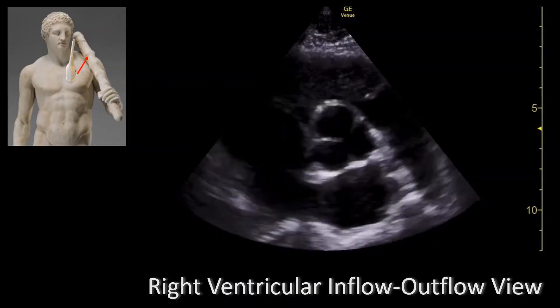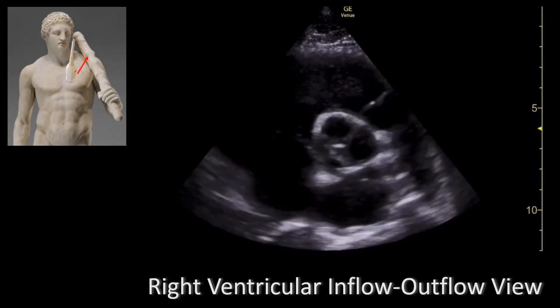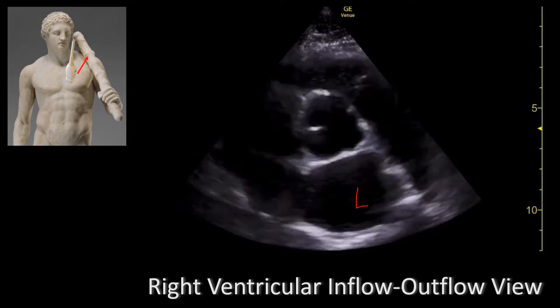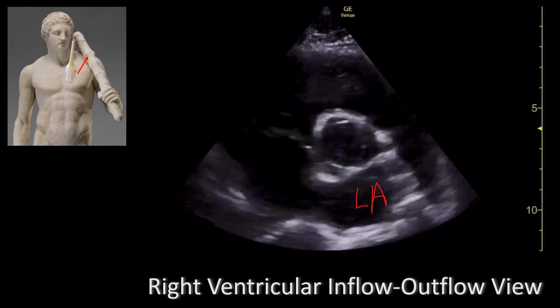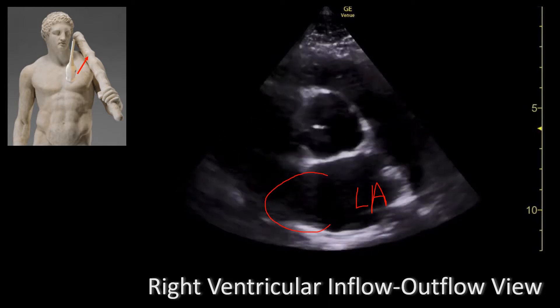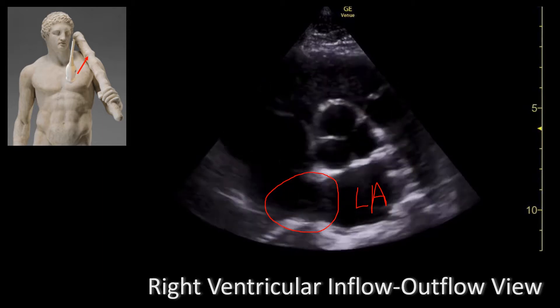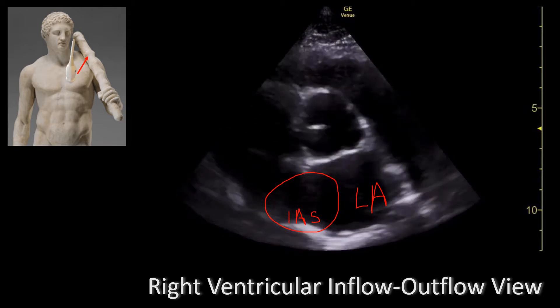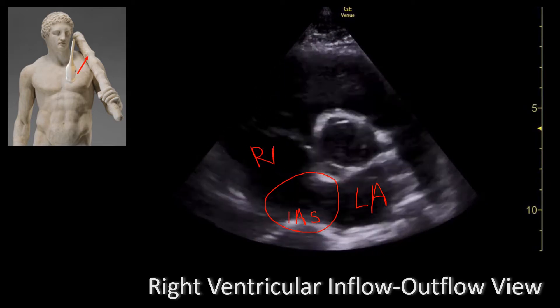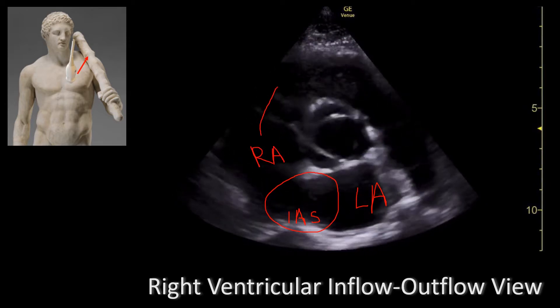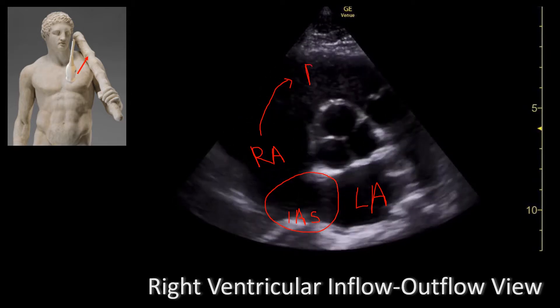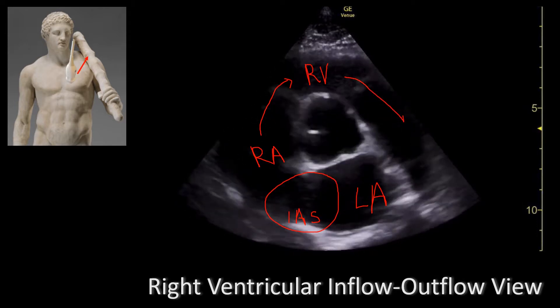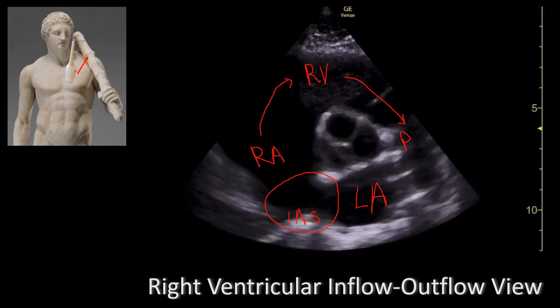Now let's talk about the structures we're looking at in the right ventricular inflow outflow view. The cavity that's farther away from your probe is going to be the left atrium. What I'm circling right now is actually not very clearly visible in this particular case, but it's the interatrial septum. On the other side of the septum you have the right atrium, which empties into the right ventricle, and the right ventricle will empty into the pulmonary artery.